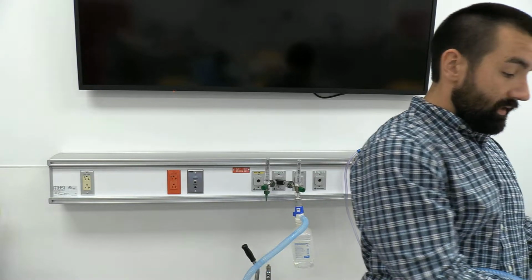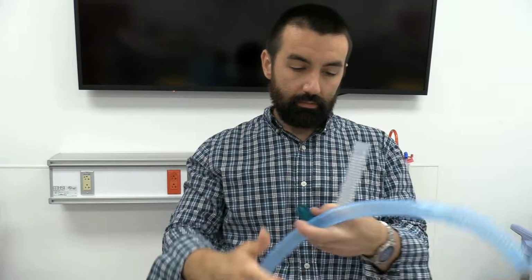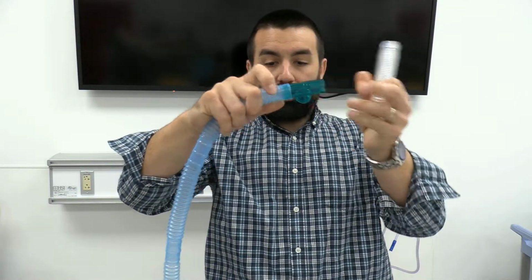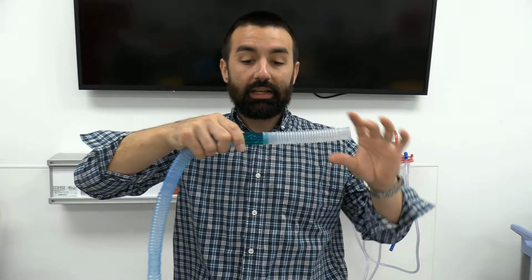So a Briggs adapter is pretty much a T-piece. The bottom piece here, in this case the one with the little ribs, would go straight onto a tracheostomy tube, so there's no straps around the neck or head; it hooks right onto an artificial airway. The supply from your large volume neb goes on one side, and then we use this little 6-inch piece of flex tubing. This one is a different color, it came from something different, but all we need is a 6-inch flex. And it hooks on right here.